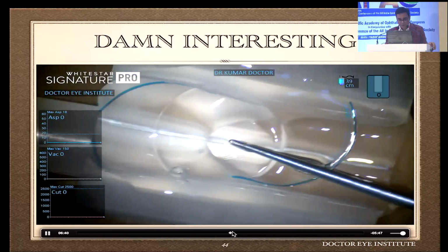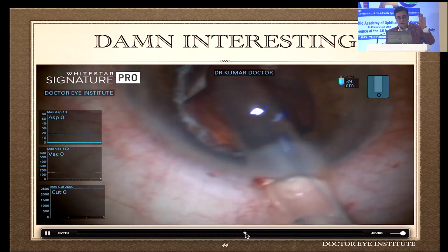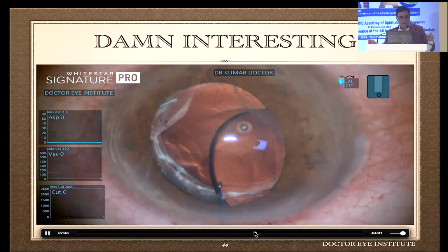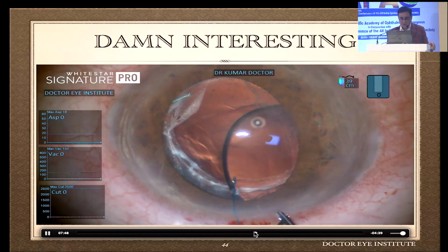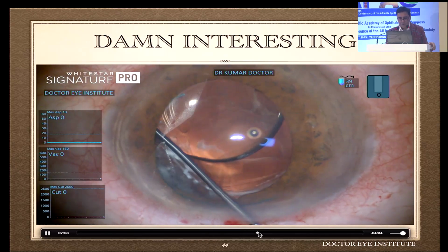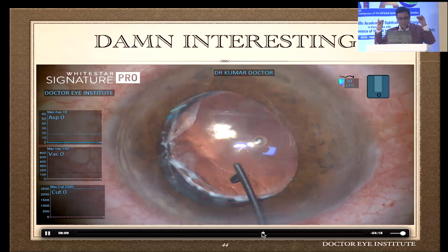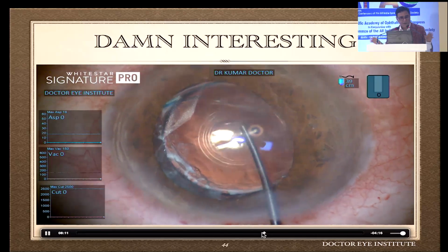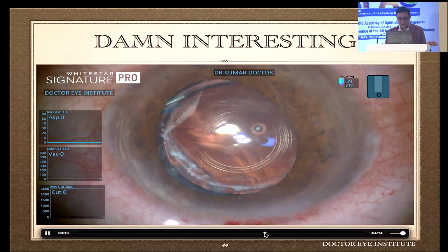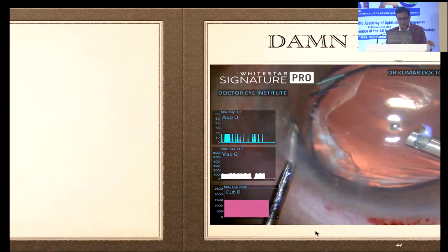So one thing we can do is 100% inject this lens into the sulcus, and because my anterior posterior fused capsule is still existing, we have to make sure that this 3-piece multifocal IOL should also not decenter in the future. So what we go ahead and do is dial the lens into the sulcus, and once that is done, I'm going to optic capture this. So you can see that I'm optic capturing into the fused anterior posterior capsule complex, and this will never allow this lens to decenter in the future. So I still gave the patient multifocality, and the patient was quite happy.